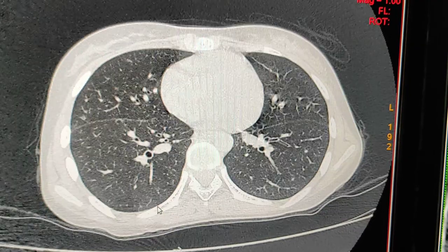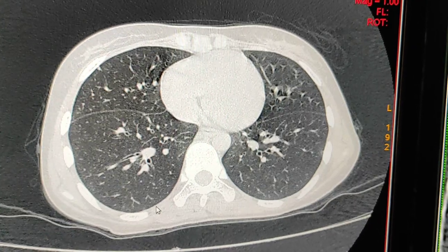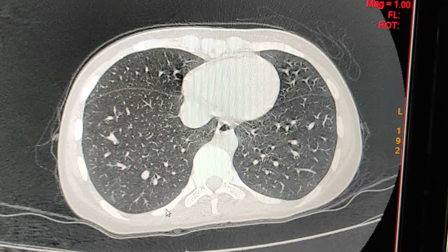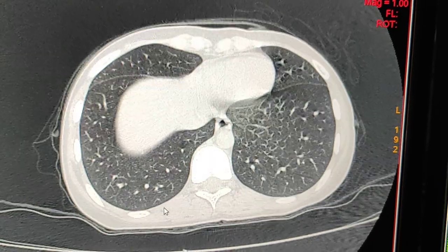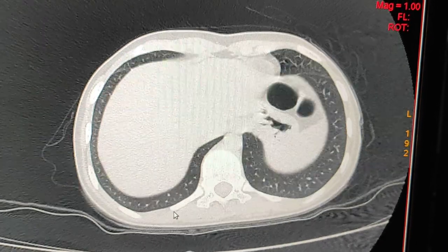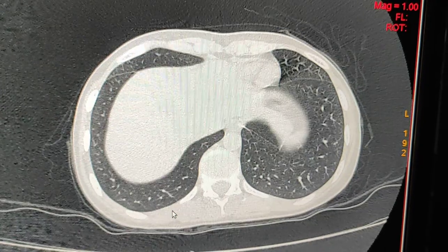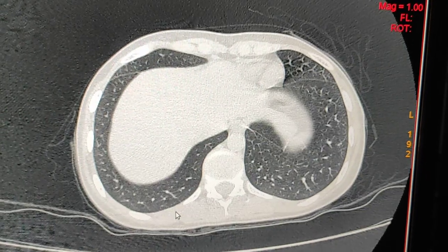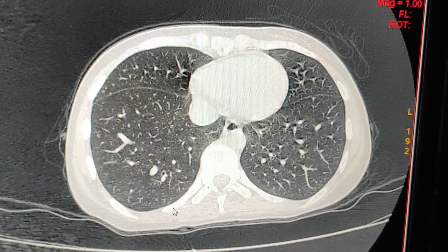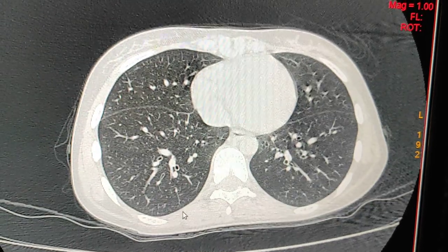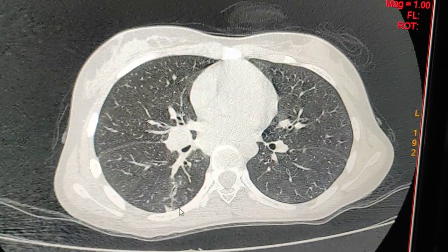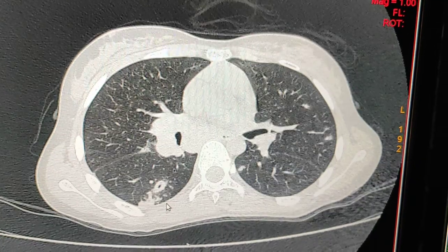The patient is having complaints of weight loss, fever, and loss of appetite. The patient came from the hospital for an HRCT scan to rule out tuberculosis in the lungs, and we have diagnosed TB.